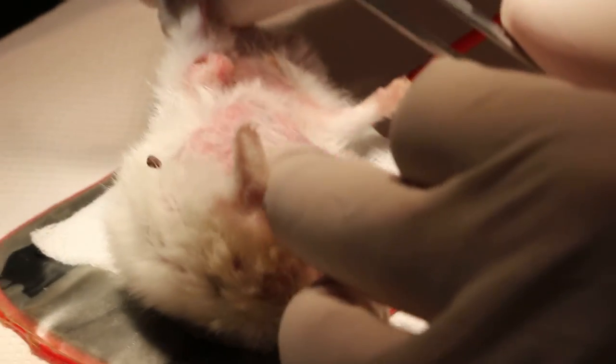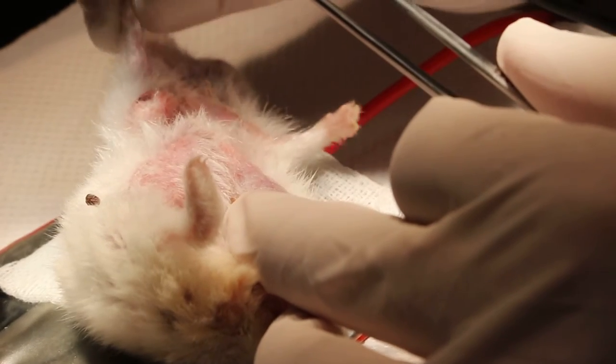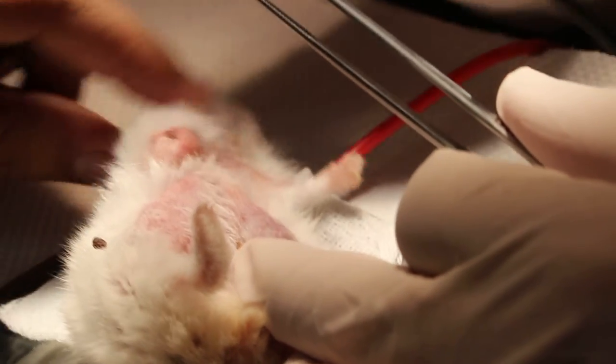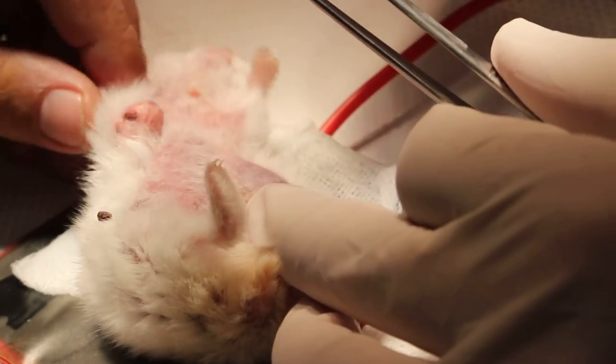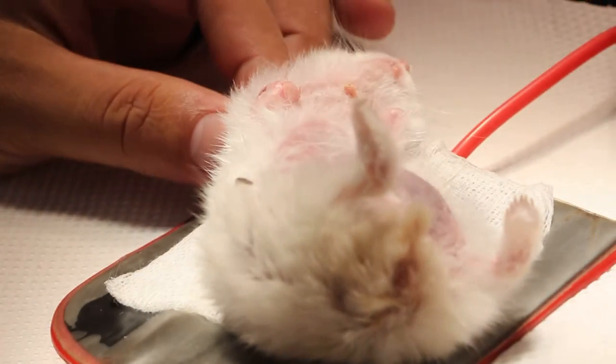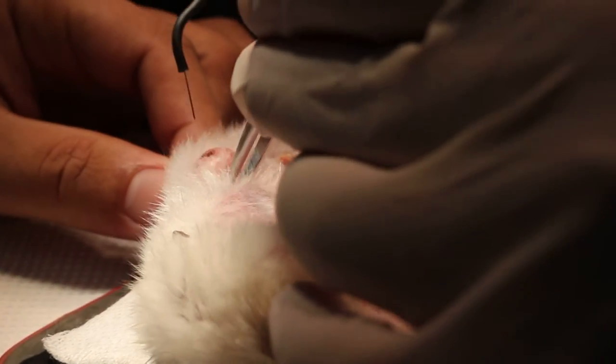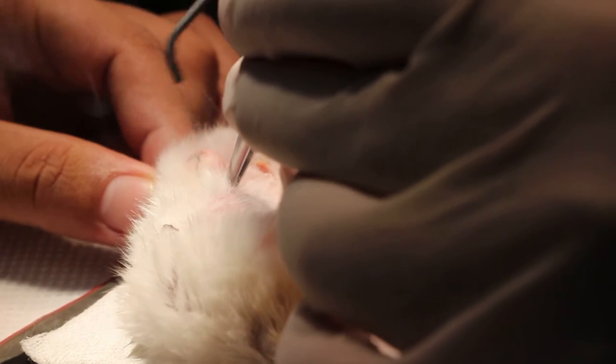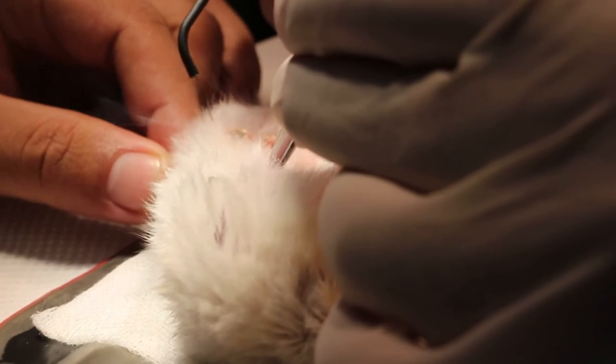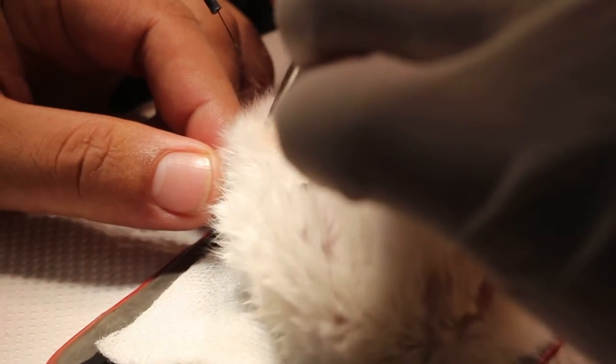Okay come, facing me, facing me. You might have to stand on the stool. You can see now. Hold the leg. This is a tumor abscess.